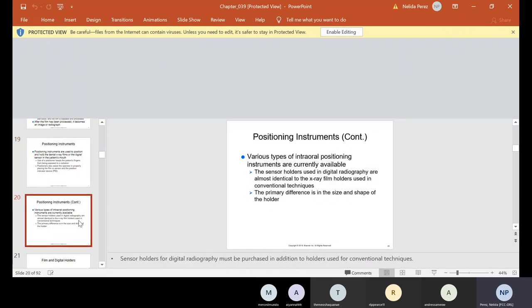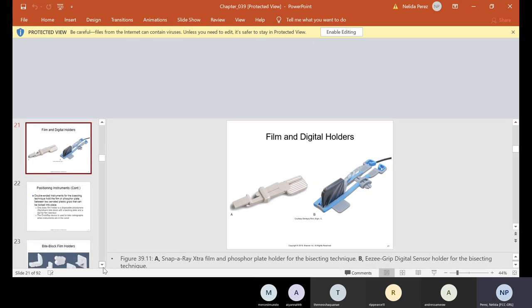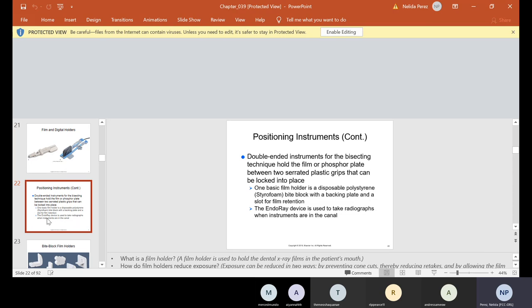Various types of intraoral positioning instruments are currently available. The sensor holders used in digital radiography are almost identical to the x-ray film holders used in conventional techniques. The primary difference is in the size and shape of the holder. These are called Snap-a-Rays or Eezee-Grip — notice these don't have the ring. The ones we're using have the ring, but this one doesn't. There are also double-ended instruments for the bisecting technique, which hold the film or phosphor plate between two serrated plastic grips that can be locked into place.